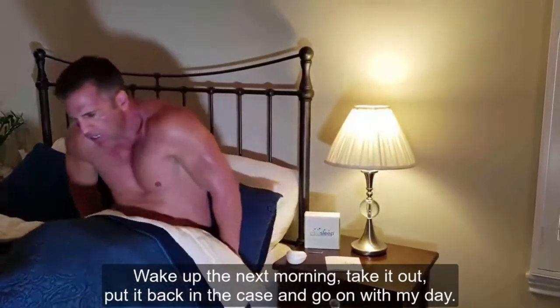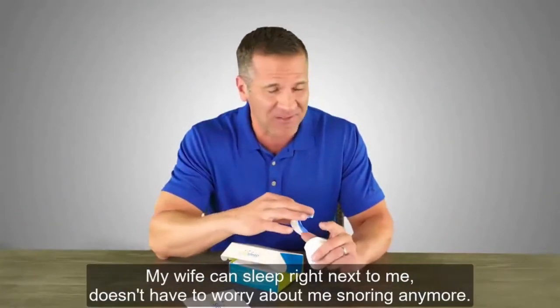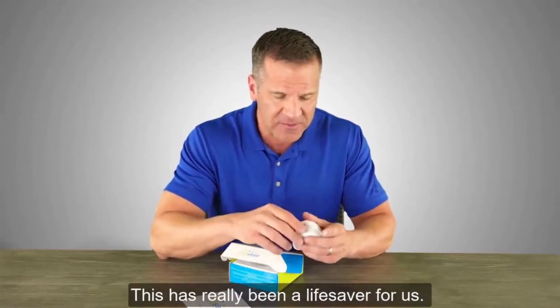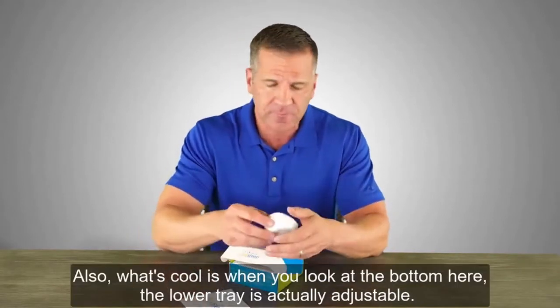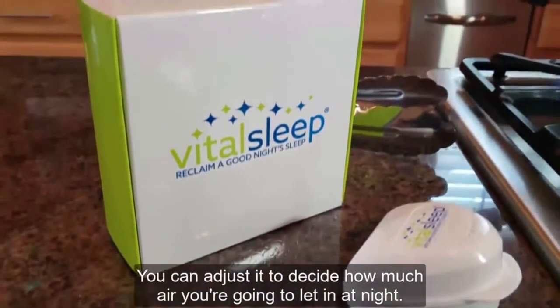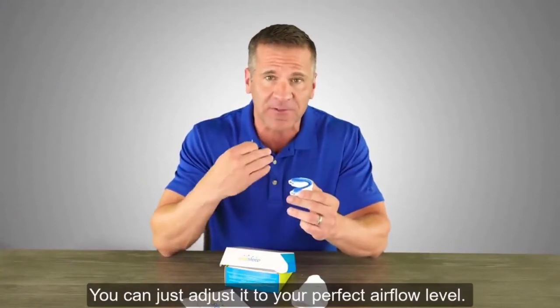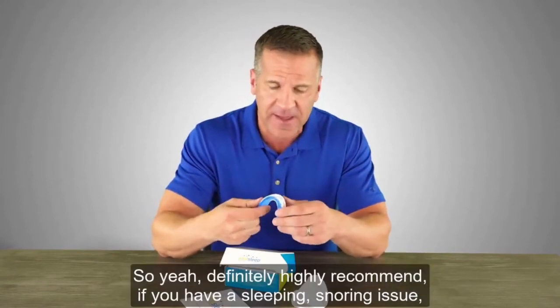I sleep great and wake up the next morning, take it out, put it back in the case, and go about my day. My wife can sleep right next to me and doesn't have to worry about me snoring anymore — this has really been a lifesaver for us. What's also cool is that the lower tray is actually adjustable. You can adjust it to decide how much air you're letting in at night. It comes with a little allen wrench so you can set it to your perfect airflow level.